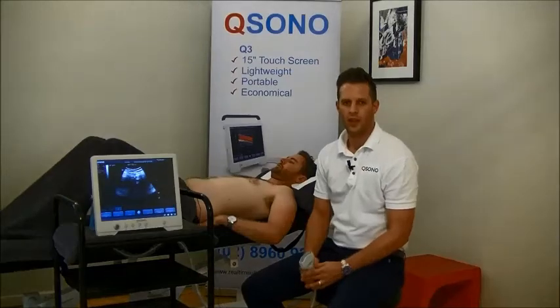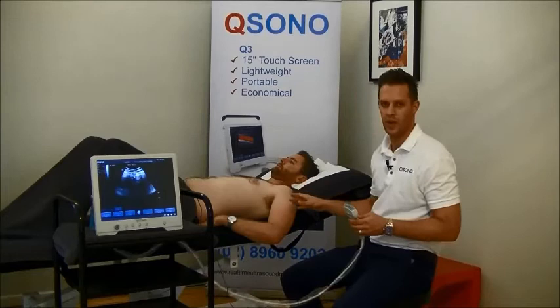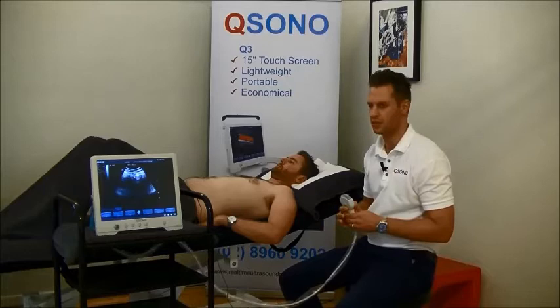Hi guys, today we're going to be looking at the pelvic floor using the Q3 from QSONO. For this you're going to need the convex probe, and the patient positioning is like this. So we've got the patient lying in supine with his hips and his knees flexed so he's nice and comfortable.